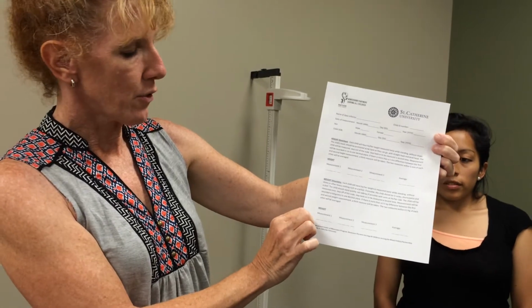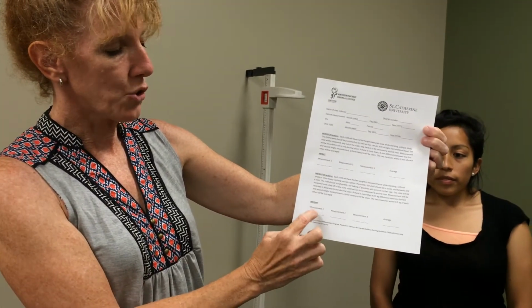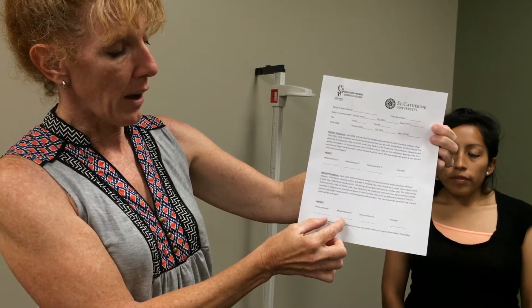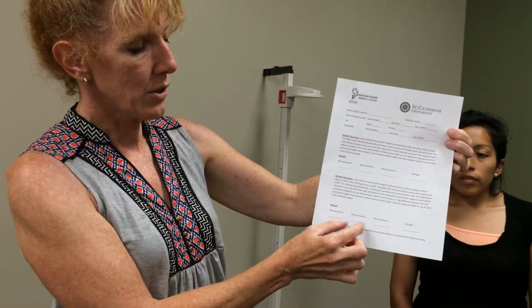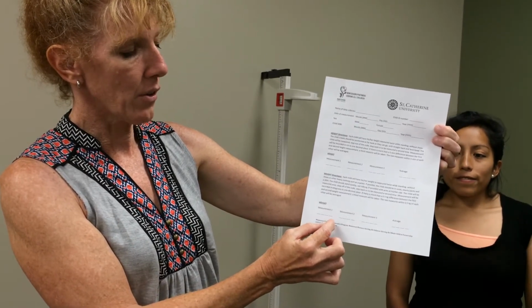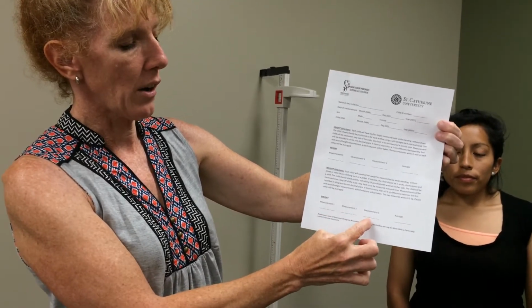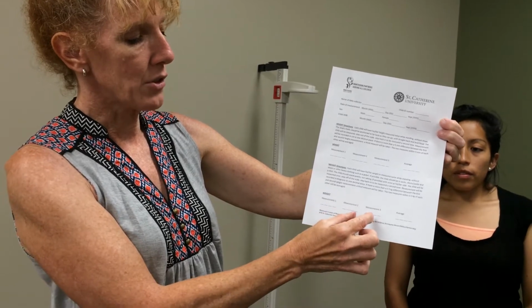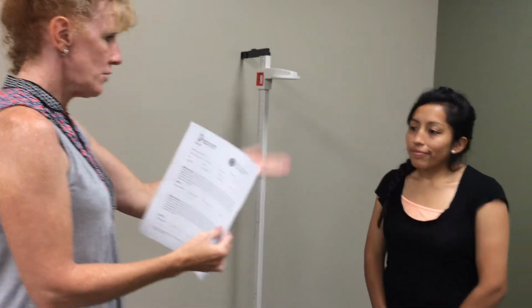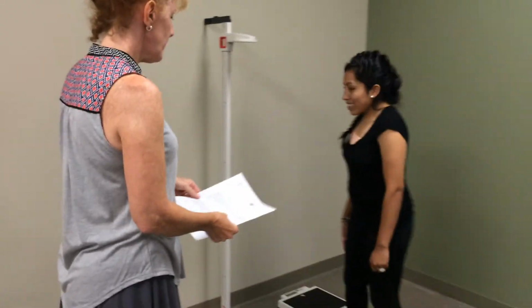The same thing is true for weight. We're asking that you measure the child twice. If the number is within 0.5 kilogram difference, then you average the two and you put the average here. If they are not within 0.5 kilograms, then we ask that you measure the child a third time and then average the two that are closest and put that number here. So we're going to demonstrate with my lovely assistant here.